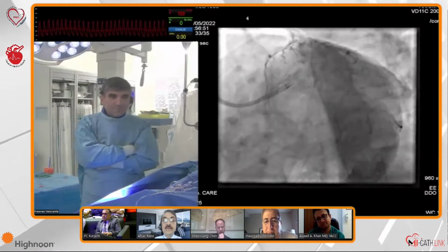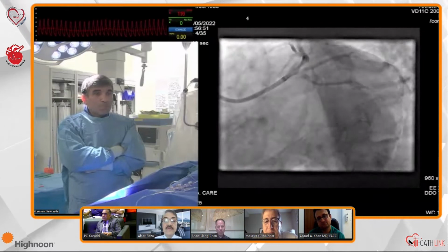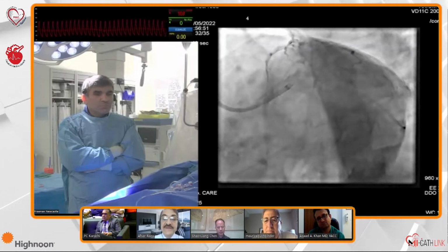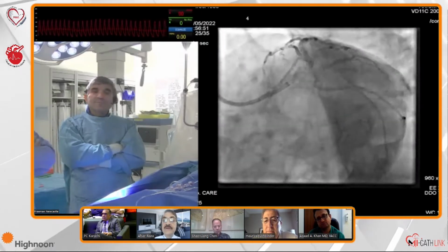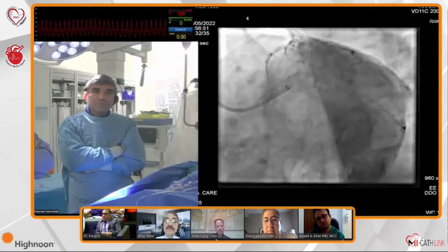So he's not online. Right, Sean, how do you think to approach this patient, please? I think this is a very, very challenging case with very severe calcification in both LAD and circumflex. So for my personal first step, I will do rota for circ and LAD too.